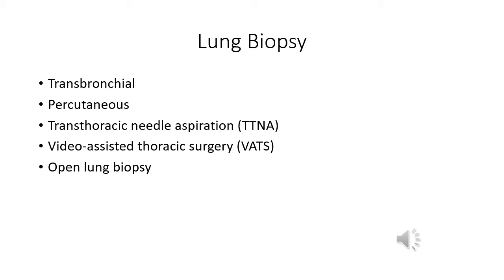A lung biopsy is performed to obtain tissue cells and/or fluid for evaluation. Specimens can be cultured or examined for cancer cells. There are a few different lung biopsy options. A transbronchial biopsy involves passing a needle or forceps through the bronchoscope to collect a specimen.